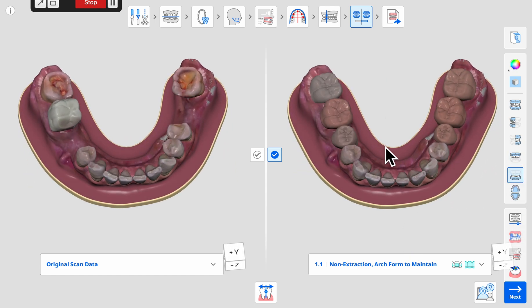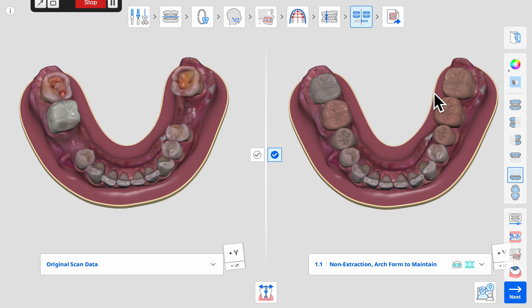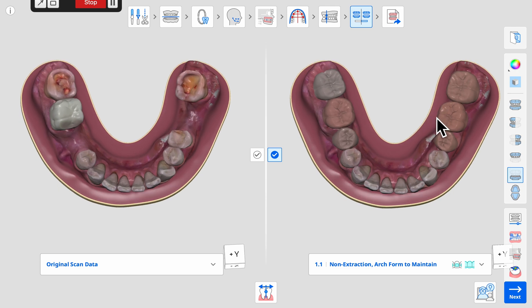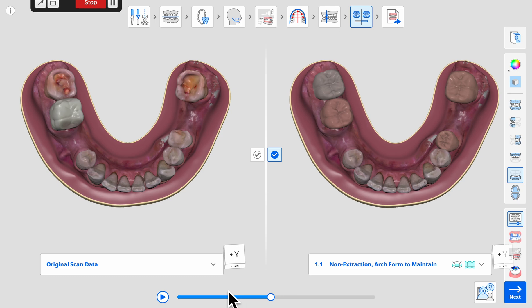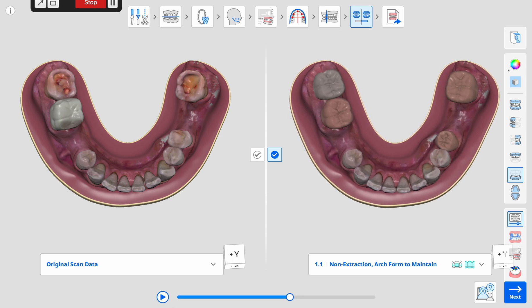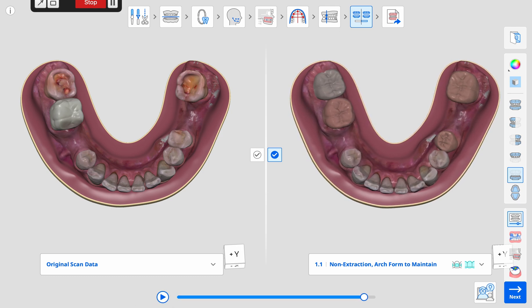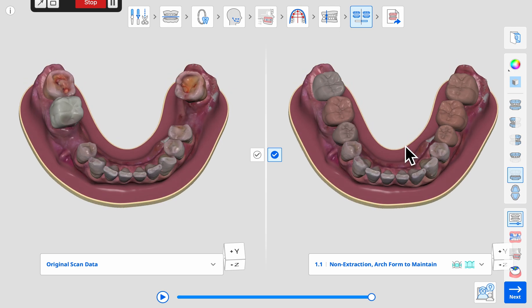The animation also aids in planning the ideal location for implant placement and considering at what stage of treatment the implant can be placed, based upon the orthodontic movements necessary for the adjacent teeth.